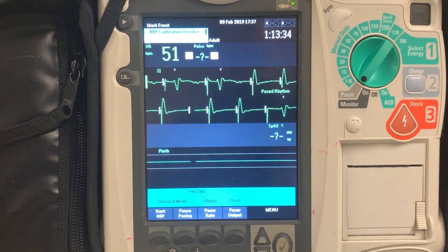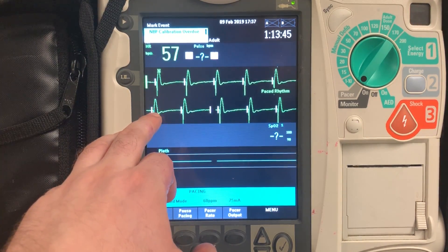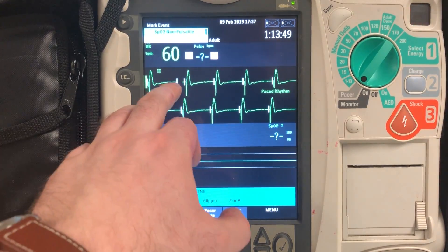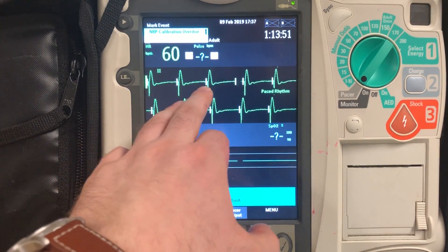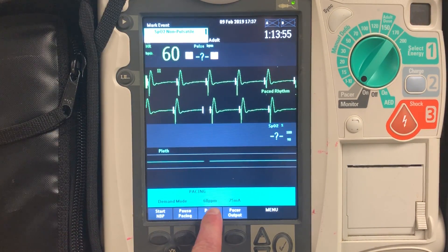So if I'm going to document on my paperwork, on my ACR, what I'm going to say is that I have evidence of electrical capture by a pacer spike, QRS complex, and a tall broad T-wave for every single pulsation that I have. And it's at 60 pulsations per minute that I have set this patient to.